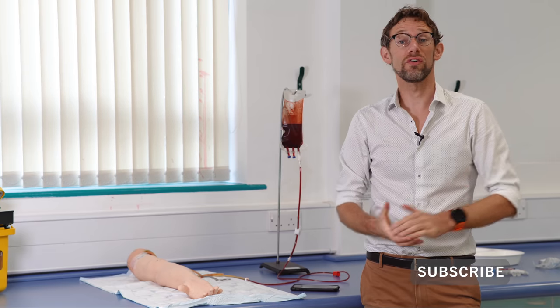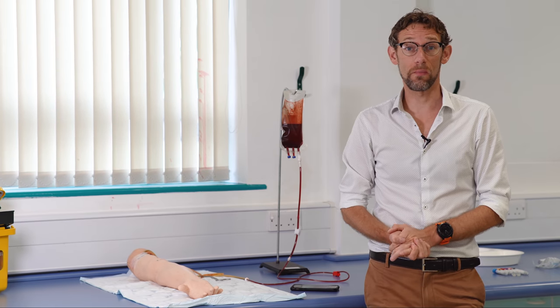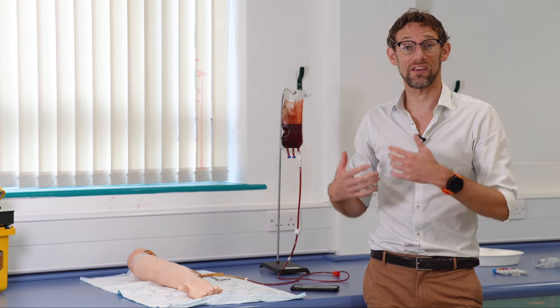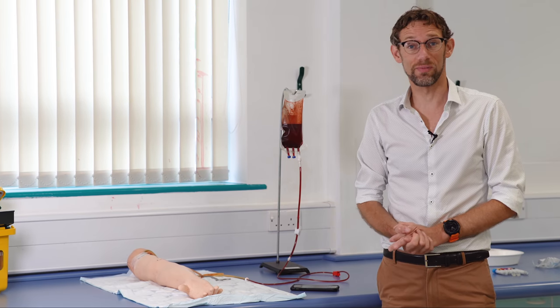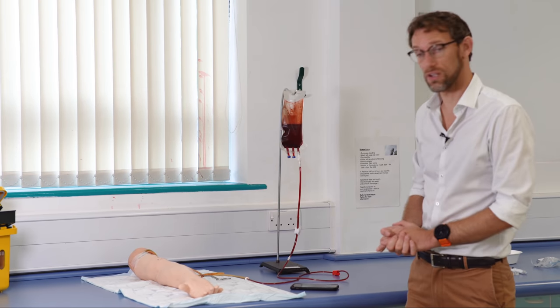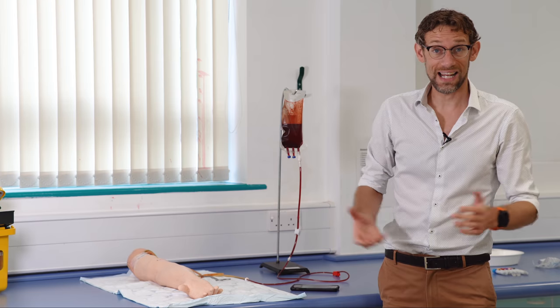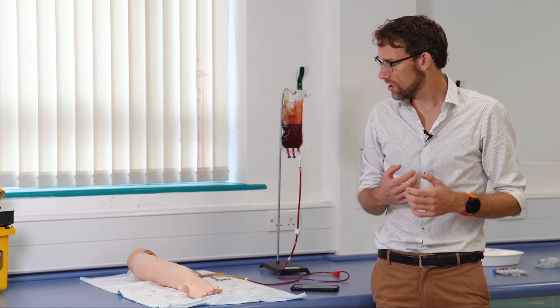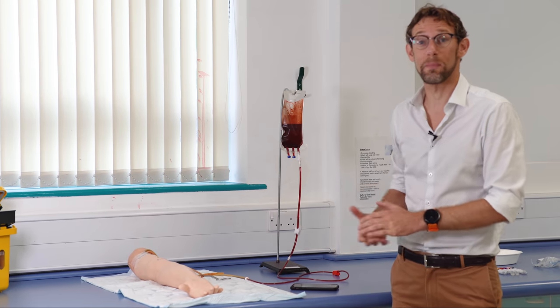Hello, my name is Dr James Gill and you join us here in the clinical skills labs of one of the local hospitals. Covid has done a number on a lot of the education that we've been able to do, so today we're going to try and do a video looking at venipuncture — taking blood from a patient's vein. Abby and my usual helpers didn't really want to put their limbs forward for this, so that's why we're here with one of the artificial arms.